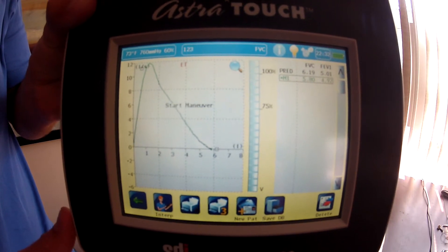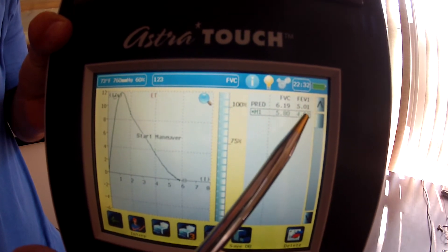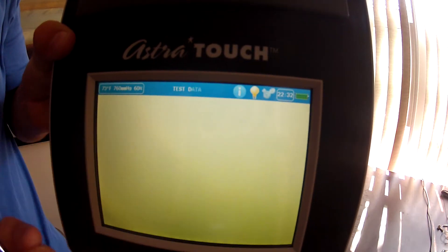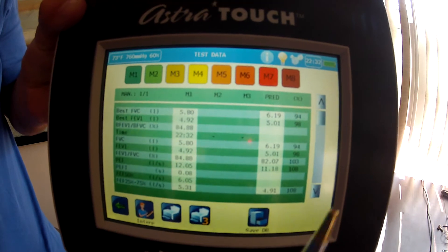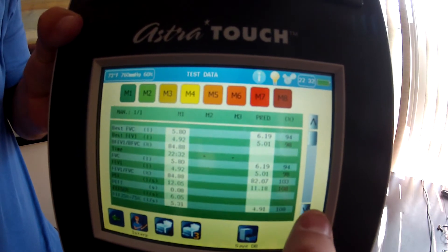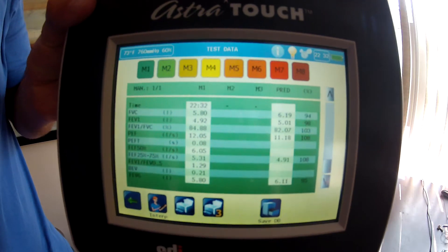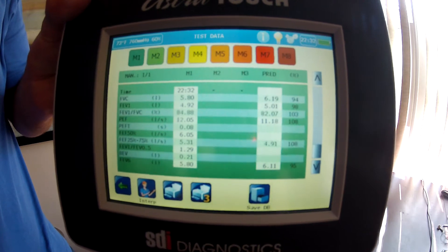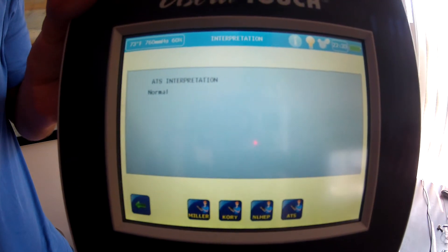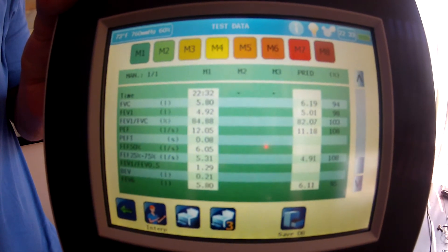I'm going to just do one maneuver. Over on this side you can see Maneuver 1, showing the FVC and the FEV1, with the predicted values above. I'm slightly under on both, but not by a lot. Touching that maneuver pulls up the screen where you can see percentages on the right compared to the predicted set. You can scroll down to see the rest of the report, and you can modify in the software what appears on the report. At the bottom, you can touch the interpretation to see the ATS interpretation or various other interpretations for the spirometry test.